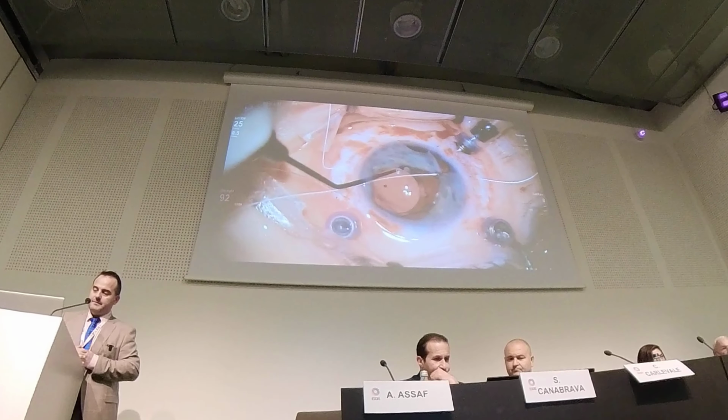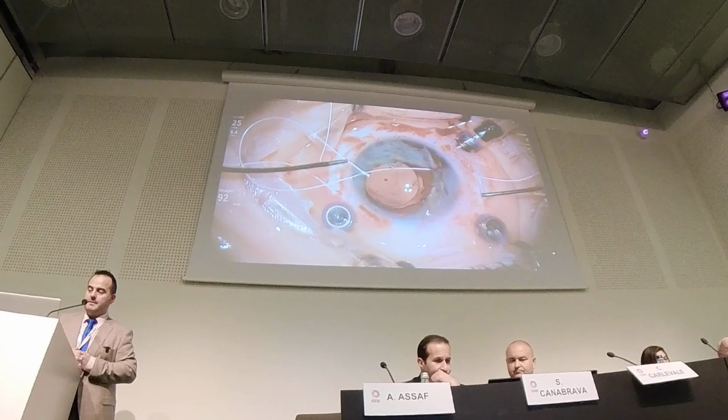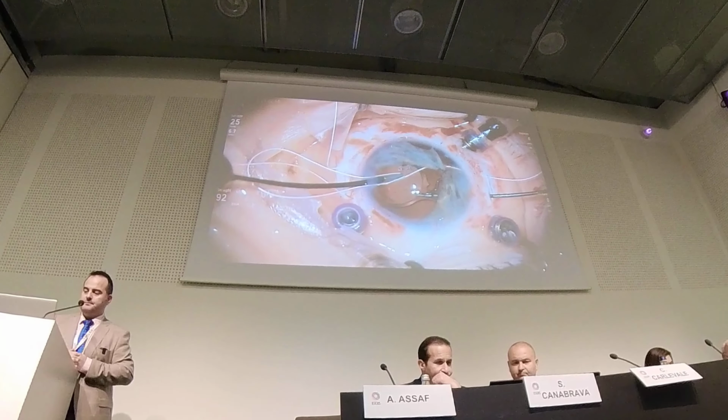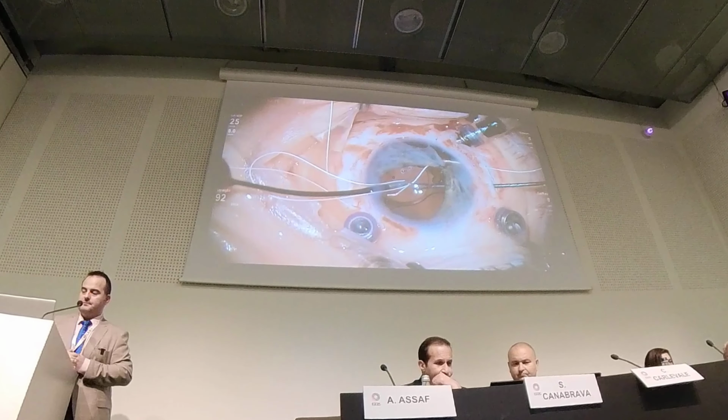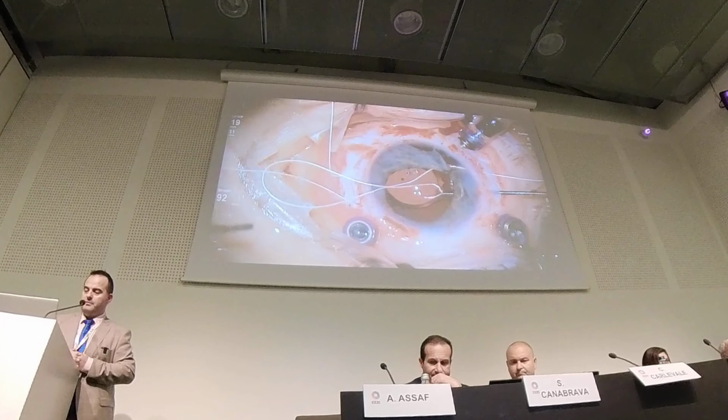So carefully you reposition the haptic, and the last haptic here. Again, the same handshake maneuver.